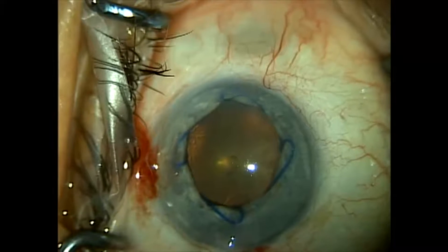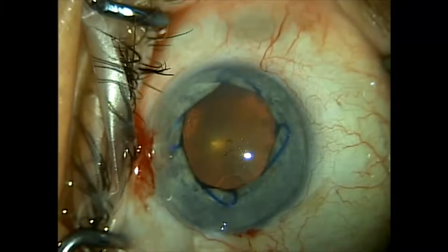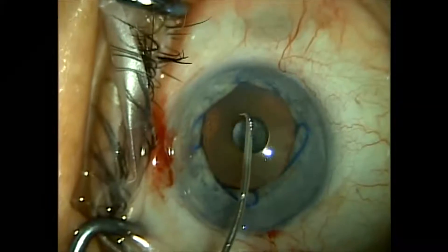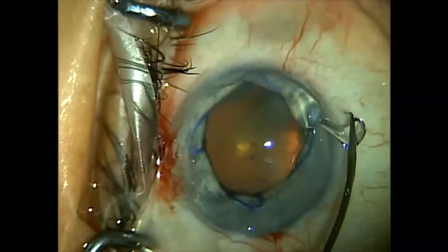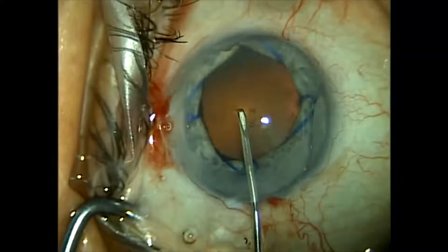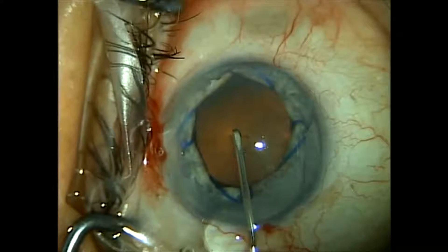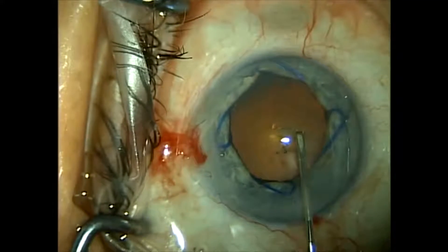This gives us a nice atraumatic widening of the pupil and we're able to do our usual capsulorrhexis. We also increase our visibility by placing Ocucoat onto the corneal epithelium. We use the Ocucoat attached to a bent cystotome to create our capsulorrhexis.